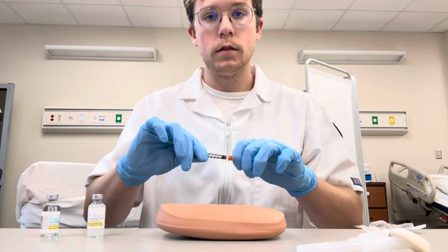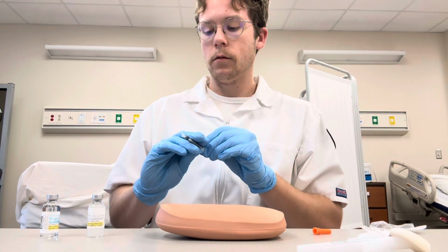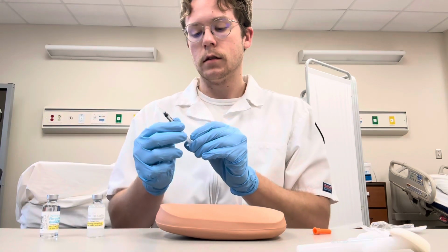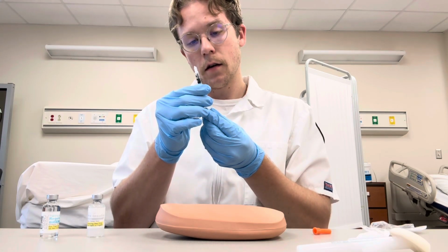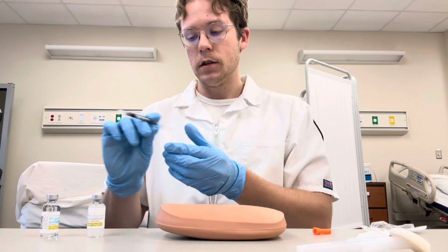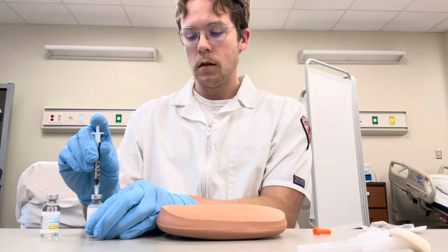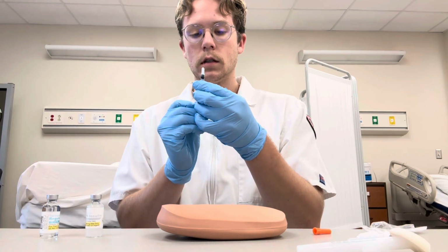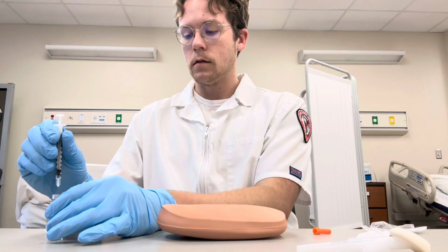All right, so we've disinfected our vials, and we're going with 16 of our NPH and 6 of our regular insulin. So we'll draw back 16 units of air and inject into our cloudy NPH first. All right, and 6 units of our regular insulin.